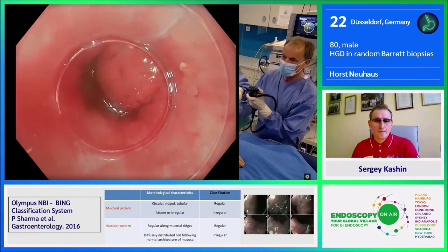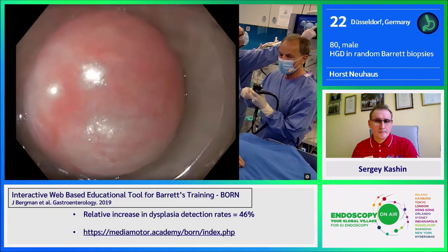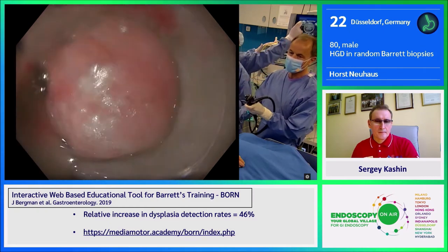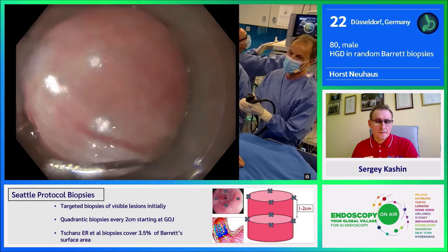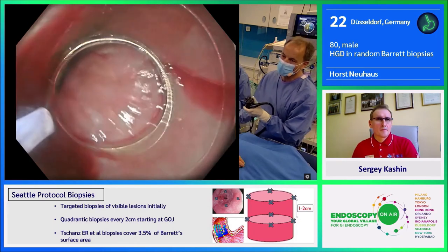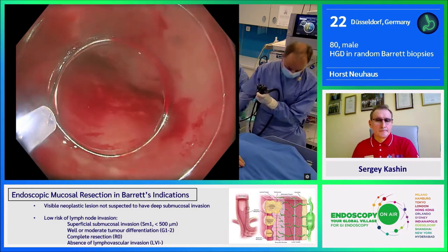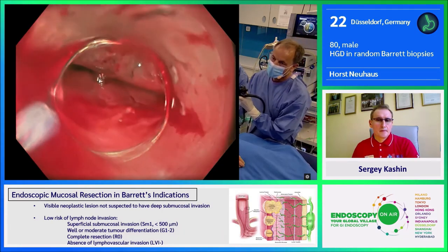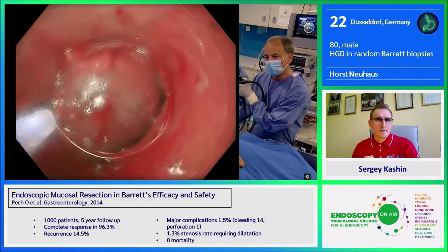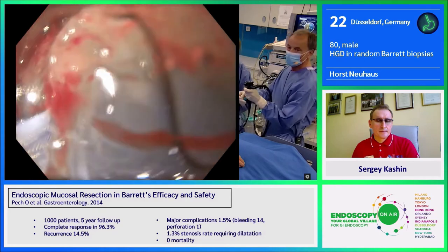We have to position the snare — the dedicated snare SD221L. I close the distal outlet of the CAP by partial suction. It's important to work very closely together with the assistant as we push the snare out. The snare is now positioned at the distal outlet, with a rim at the distal part of the CAP. There is minor bleeding. We identify the area, then do a test suction and jiggle a little, and now it's very important to close it completely — it's now closed.